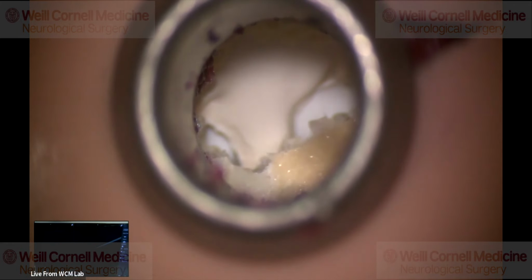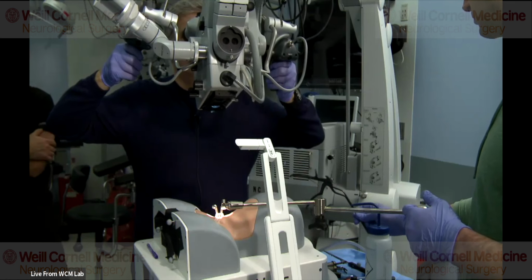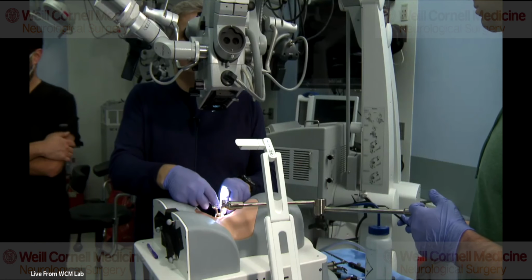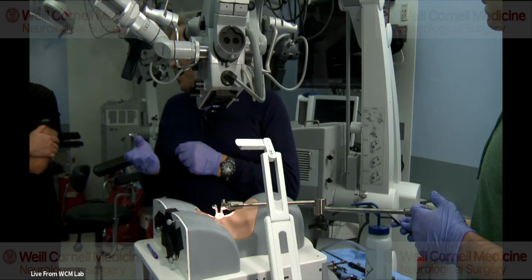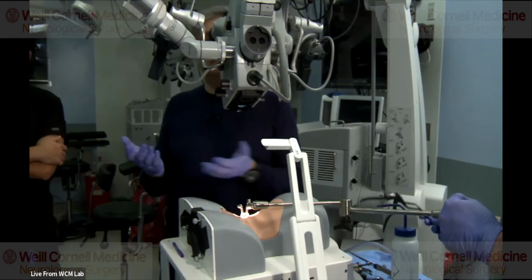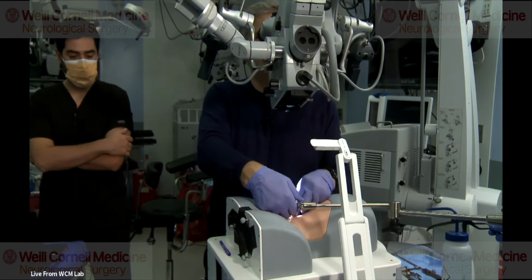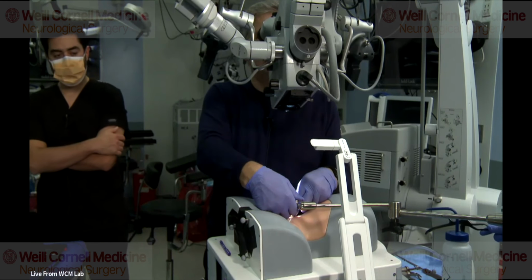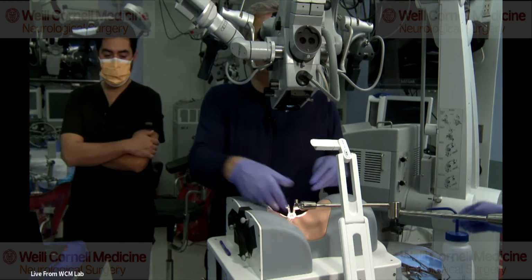We have a good question. If you wouldn't have navigation, how would you judge how much of the facet you have? In that case, I would angle the tube more lateral, and I would actually try to feel with some instrument, with a Penfield or something, the lateral edge of the facet. I'm not going to do it now here, but you can aim the tube more lateral, and you get a sense for how big the facet is.